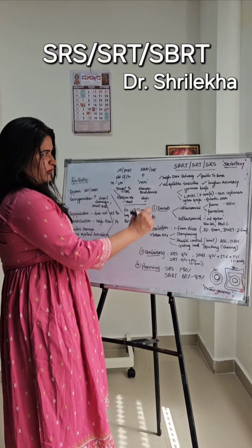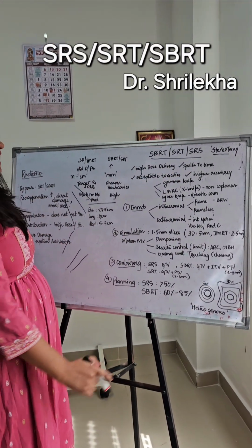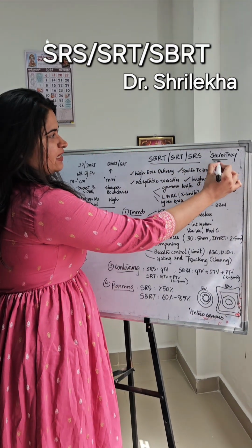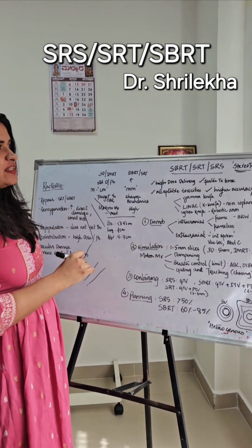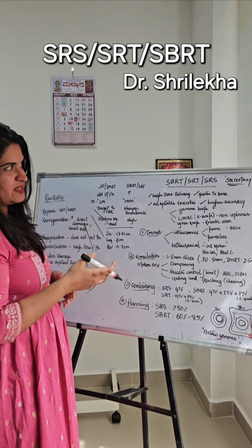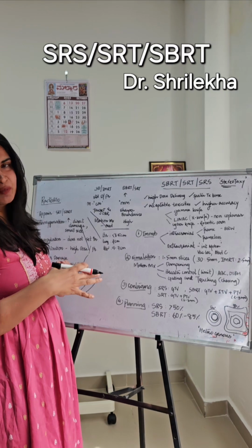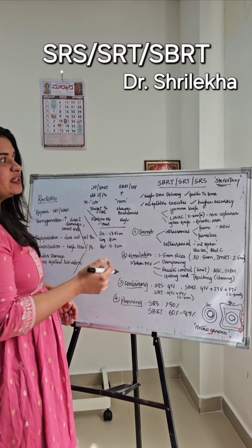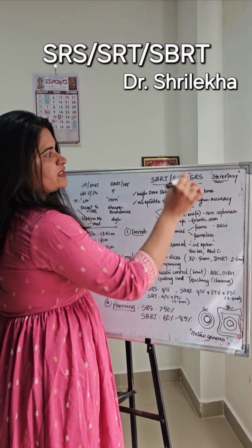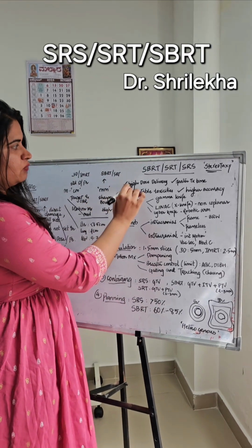Hi, today I'm going to talk about SBRT, SRT and SRS. All of these have this term stereotaxy in them. So what is stereotaxy? Stereotaxy is some motion that is happening in space. Unlike 3D CRT and IMRT, this is something where we are concentrating in space and targeting a volume.